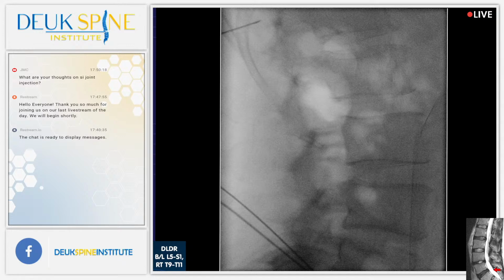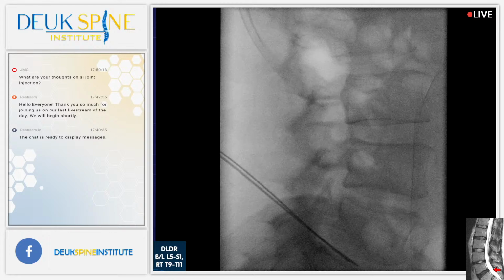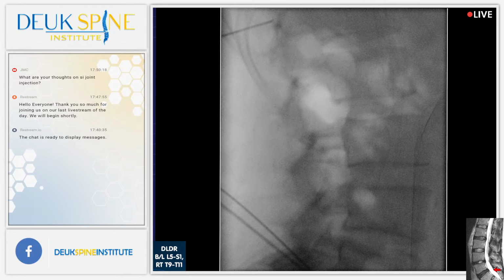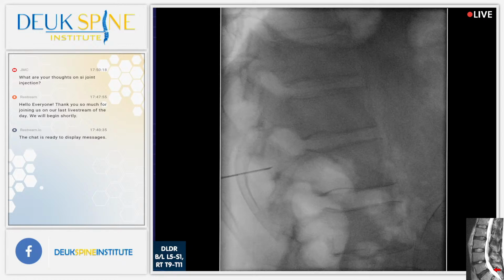Should be right on the set. So we know that, let's go south just for a second. Shot. That's 5. Now move up. Shot. 4. Move up. Shot. 3, 2, 1. We're at 1, right? Yes, sir. Move up a little more north. Slowly. Shot. Okay, that's still 1. Right? Everyone agrees I'm at 1. Yes, sir. Can feel it.